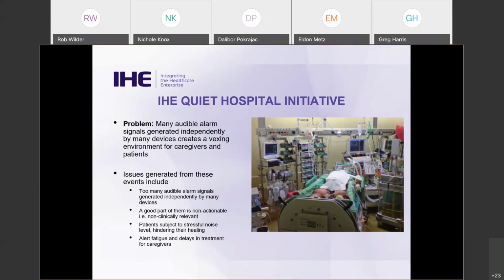Now, while it's known that much work has been done individually to address alert fatigue in the years since it was first recognized as a problem, cross-functional issues driven by limitations in data sharing and imperfect interoperability methods have left a big gap, and it complicates the ability for us to truly respond and solve this problem.